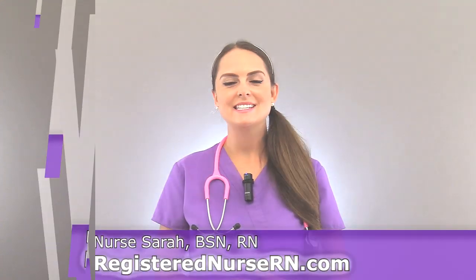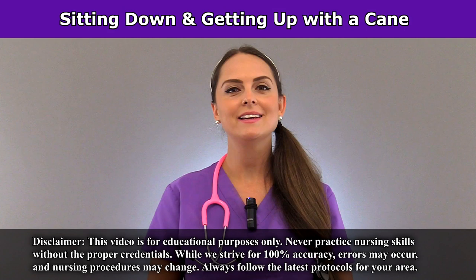Hey everyone, it's Sarah with RegisterNurseRN.com, and in this video I'm going to demonstrate how to get up and sit down in a chair with a cane.